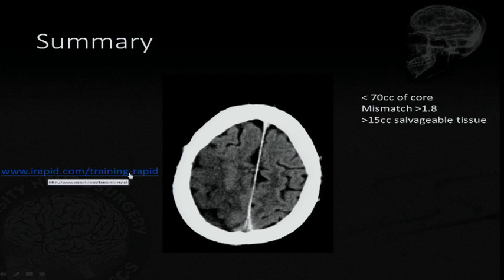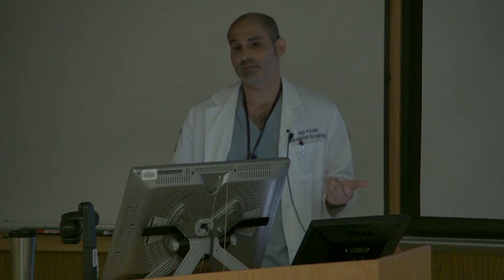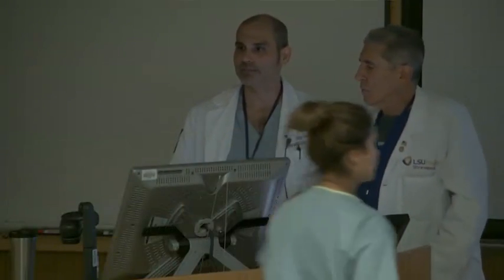Based on occlusion, why are we doing it for the MRI but not for the CT? What was the purpose behind it? The CT doesn't work for the posterior fossa. And after 12 hours, there may already be a big brainstem stroke, so I want to make sure that if I'm going to do the thrombectomy, there's something to save. Thank you.